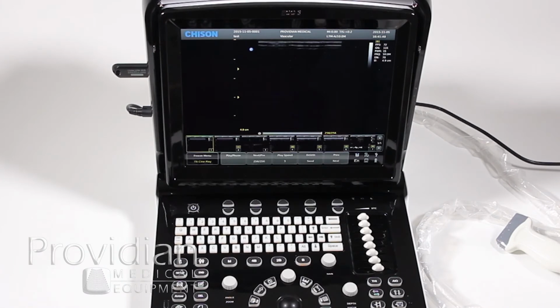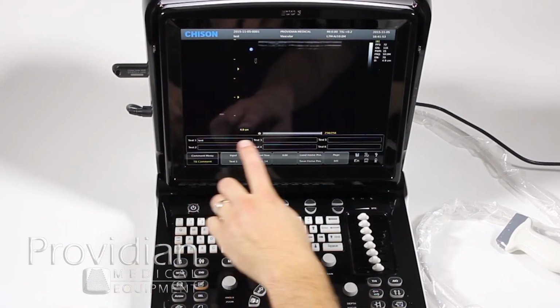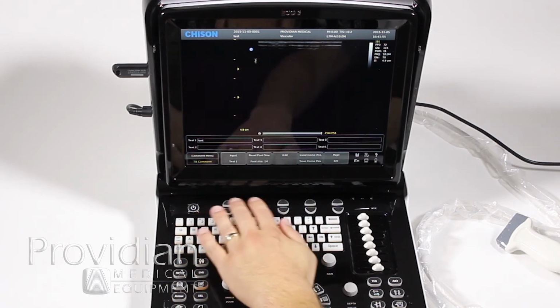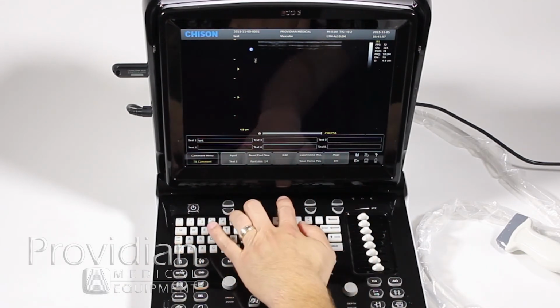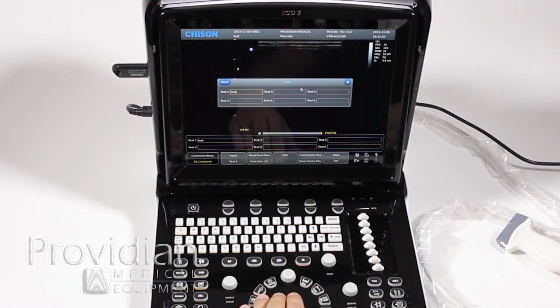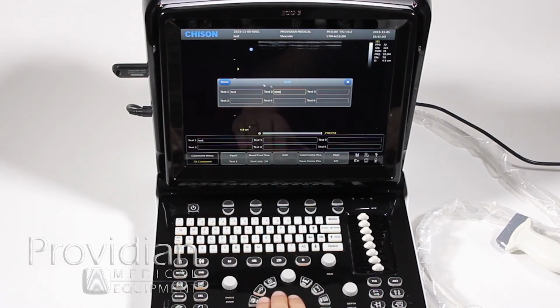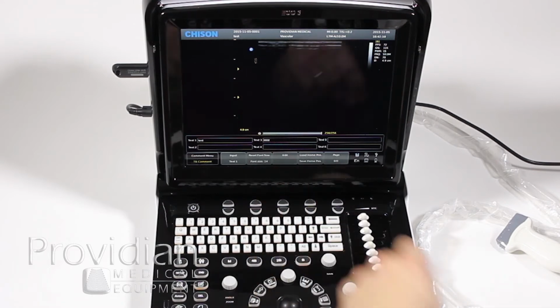For the quick text feature, we're going to go back to that annotation button again. And we saw this down here. If we want to change all these down here, I'm going to click the edit button. And here they come up top, and you can just type in whatever you want. Just a bunch of T's. Click done. And so now that showed up down there.